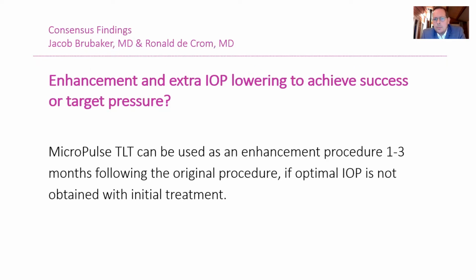And if you look at enhancement in some patients, there are also patients who have a good response to your treatment, but you want a better response or more intraocular pressure or more medication reduction. In these patients, MicroPulse TLT can be used as an enhancement procedure. And most of the time also here, you have to wait 1 to 3 months after the primary procedure if optimal intraocular pressure is not obtained with the initial treatment.